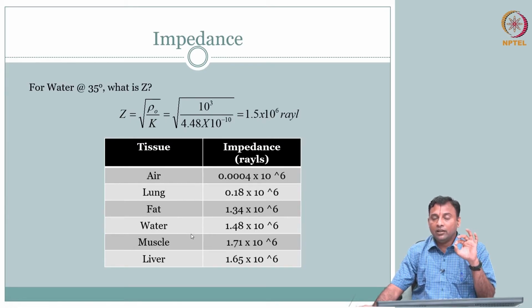We will not cover more than that here, because we need to talk about the interactions in more detail. But you recognize here that because of this impedance difference between the various tissue types, ultrasound is inherently useful only for certain clinical applications.